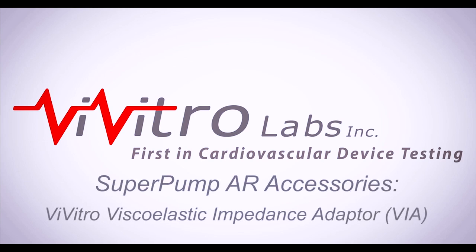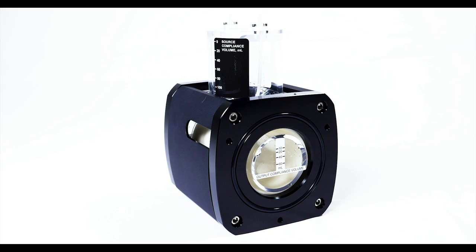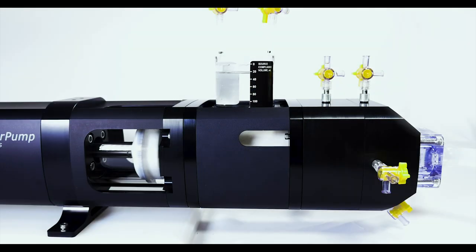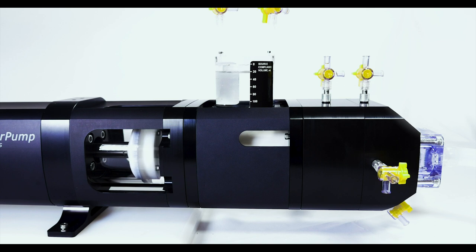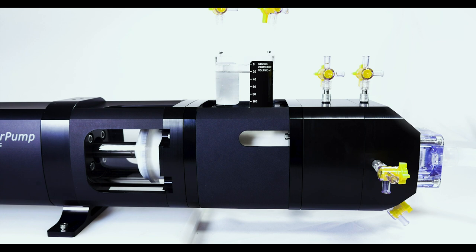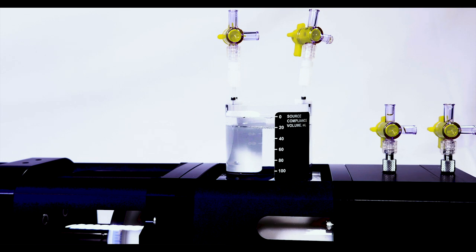The optional viscoelastic impedance adapter or VIA works in conjunction with the super pump to produce more realistic physiological ventricular pressures. It consists of a fixed resistive element and two adjustable compliance chambers to mimic the viscoelastic nature of the native ventricle.